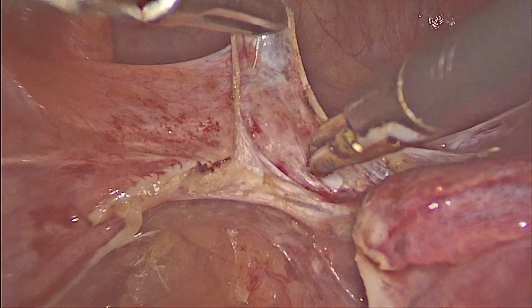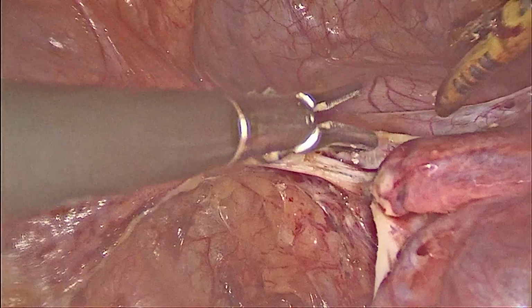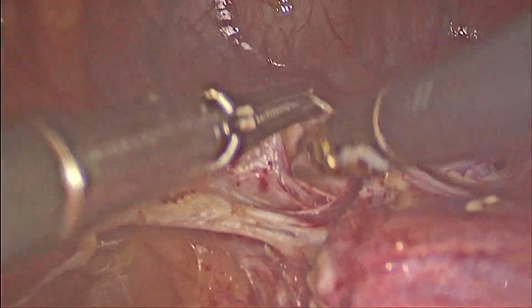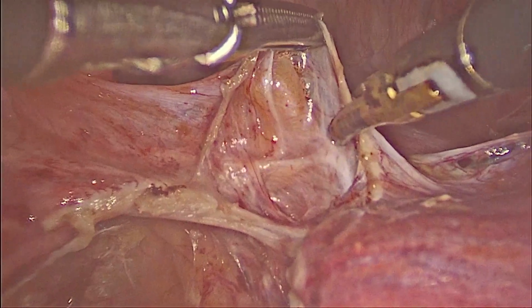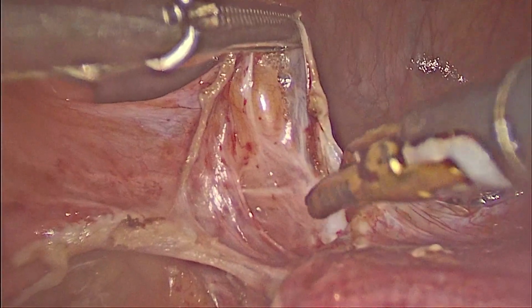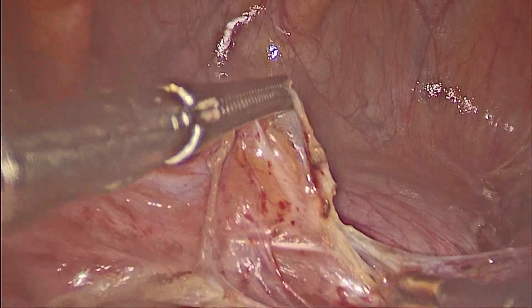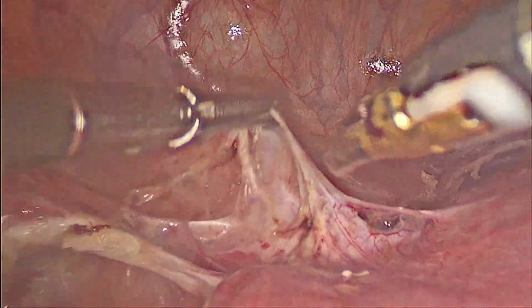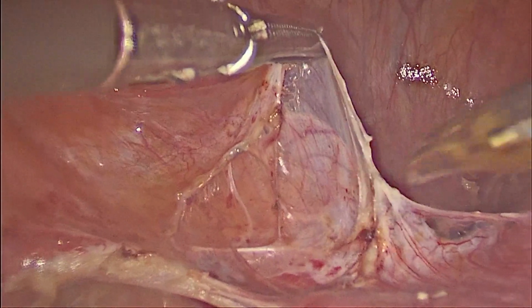Here a little patience is necessary to find a proper plane between the bladder and the cervix, so that we do not inadvertently injure the bladder. If it is injured, we can very well suture it, but most important is that you should not fail to identify the injury to the bladder, which can lead to fistula formation in the post-operative period, which is more difficult to treat than treating it in the intraoperative period.